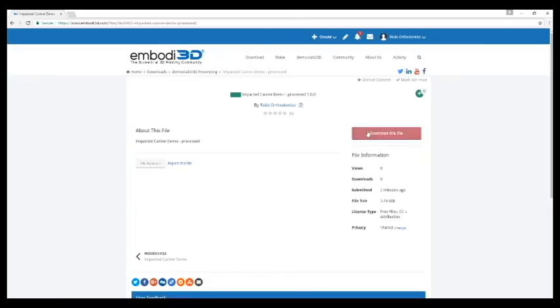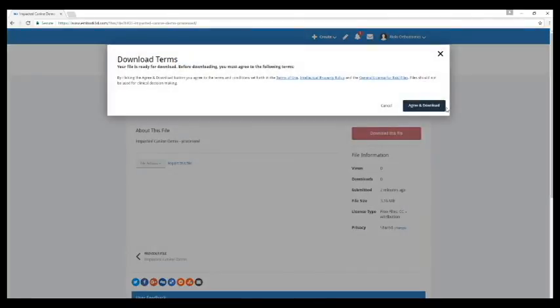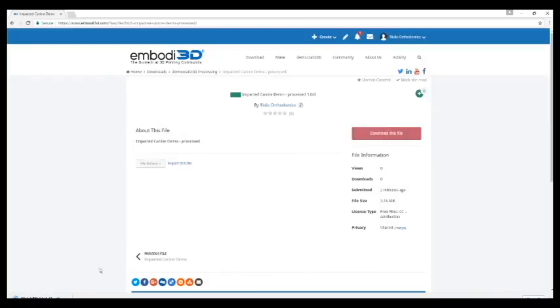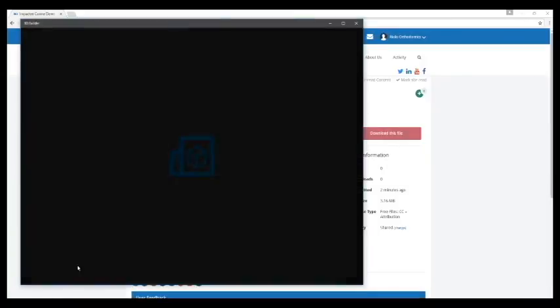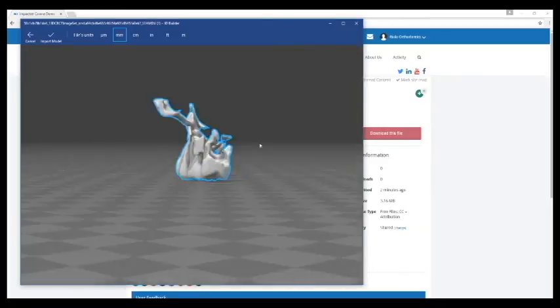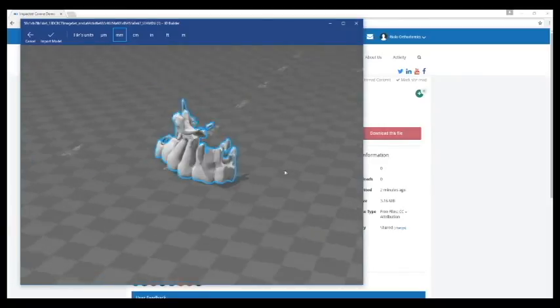So we can go ahead and download this file. Agree and download. And here we have it.